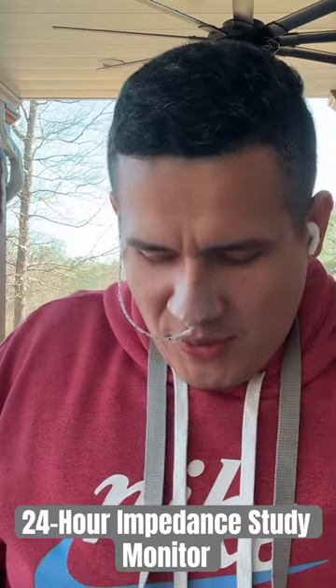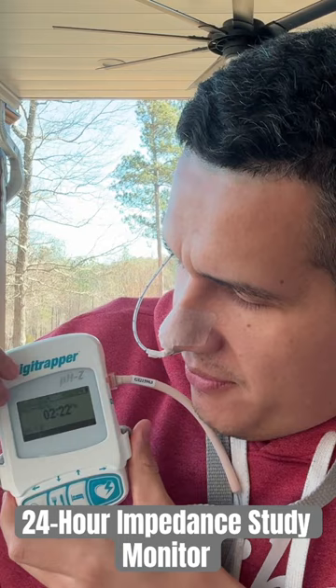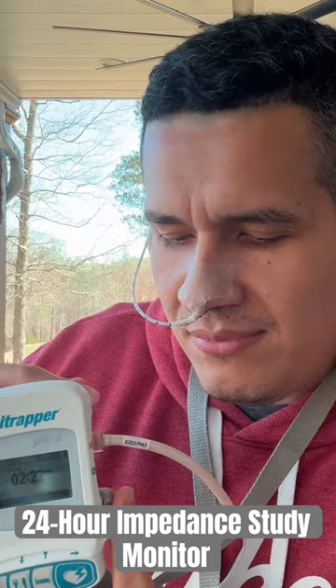Let's go into what they gave me that I'm supposed to be carrying around, which is this little friend right here. As you guys can see, I'm gonna turn it around real quick so you guys can see better. It gives you a time, it's connected to this right here, and I'm supposed to have this around — this little thing goes all the way under my shirt.